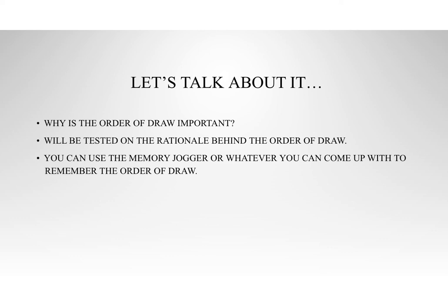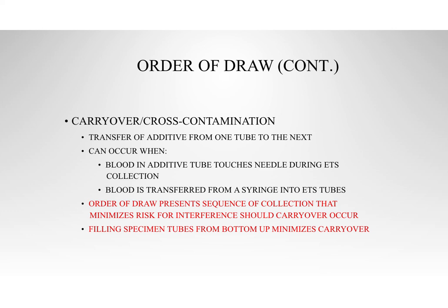And I have mine. You also need to know the order of draw because a lot of other people don't, and often they're asking you what it is. So definitely important to remember, okay? You get tested on it a lot. I know I've even had them ask me the order of draw in job interviews, okay? So very, very important. So let's get into it.